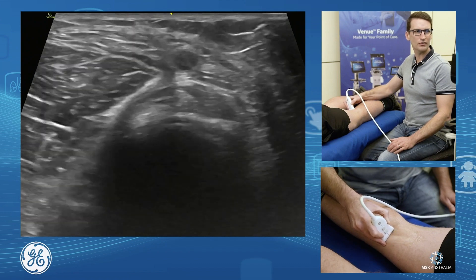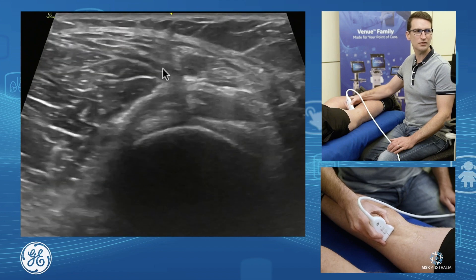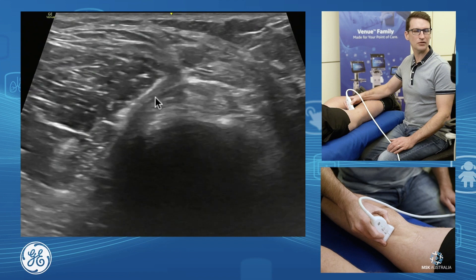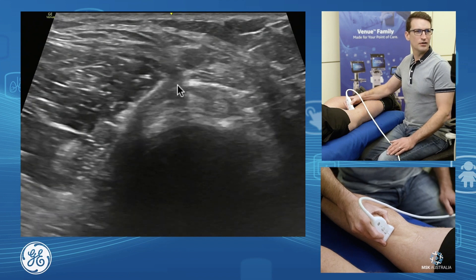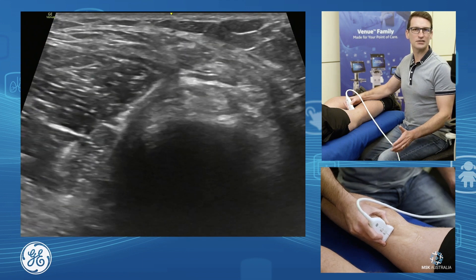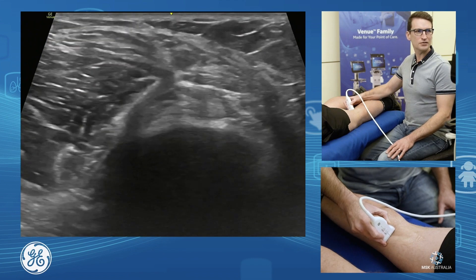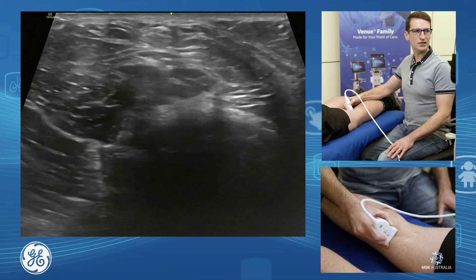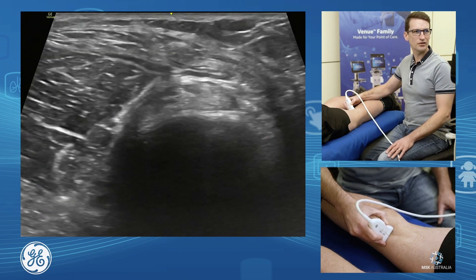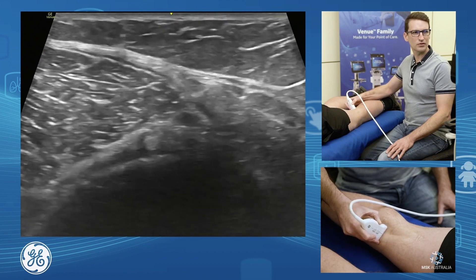As we come back up, we can see here our medial gastrocnemius tendon. So medial gastrocnemius and our semi-membranous sitting next to each other. And this is where we have our semi-membranous gastrocnemius bursa — this is where our Baker's cysts form. This is a common spot for us to look at, and this is where we will be doing our Baker's cyst aspirations. We can see those two tendons in close proximity to each other, with our semi-tendinous over the top, coming down through onto the bone.